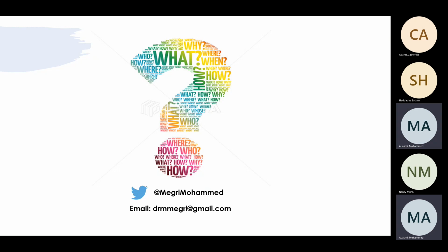So the machine will say, okay, I will stop if the volume reaches 500. I will stop, not by the volume measure, but if the patient has three sequences of breaths with this minute ventilation. That's not a set point. I'm not the one who said that. That's the machine taking control of that. That's when you say adaptive. But with dual, I'm doing some and the machine is doing some.